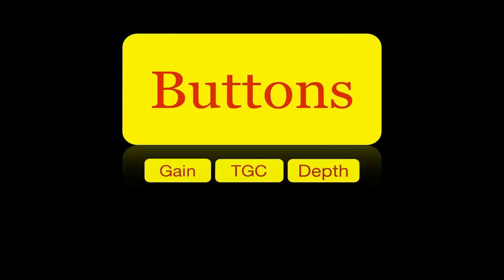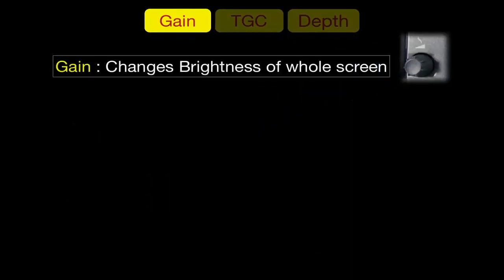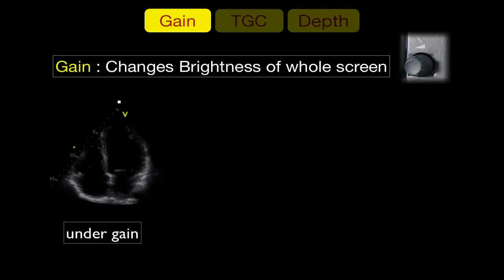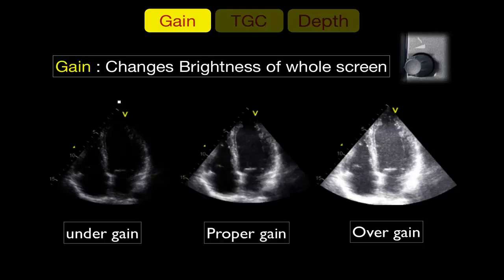Regarding important buttons: Gain is probably the most common button you will use. It simply changes the brightness of the whole screen. For example, in this cardiac view, if the image is very dark we are under-gained, and if the image is very bright we are over-gained. You want to adjust the brightness so you can see the cardiac cavity as a black area while still having good delineation of the myocardium.